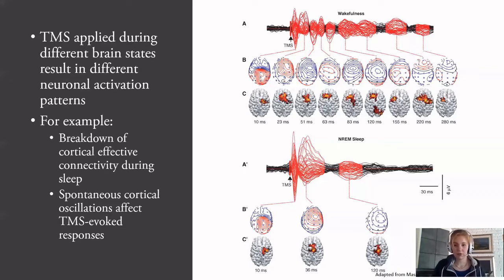In this study, we were interested in how the phase of the cortical oscillations affects TMS-induced signal propagation, meaning how stimulation during different local cortical excitability states might affect where the TMS-induced activity spreads after the TMS pulse. And the hypothesis is that the signal will spread to different distant cortical regions from the stimulated site, depending on the pre-stimulus phase of the mu and/or the beta rhythms at the stimulation site.